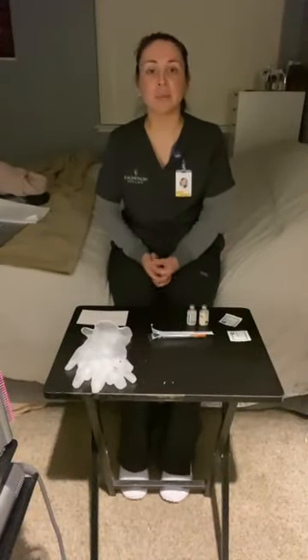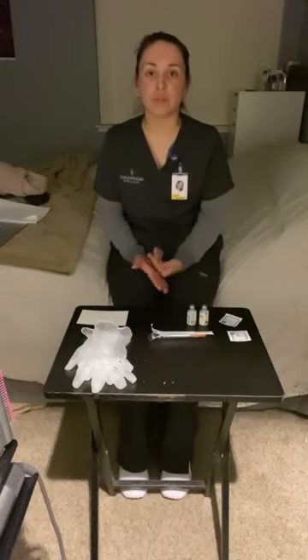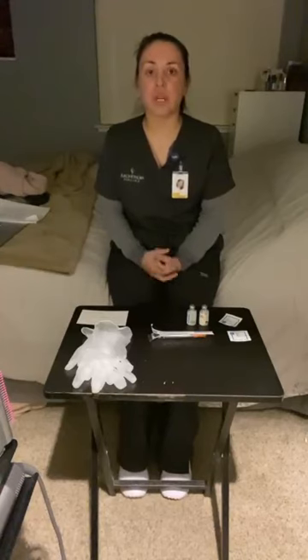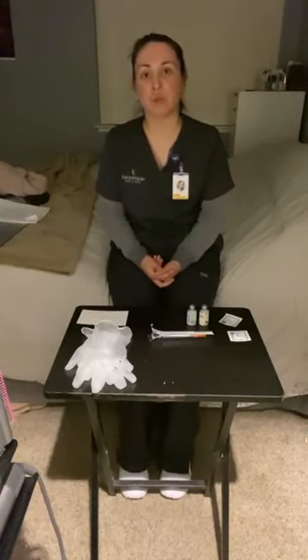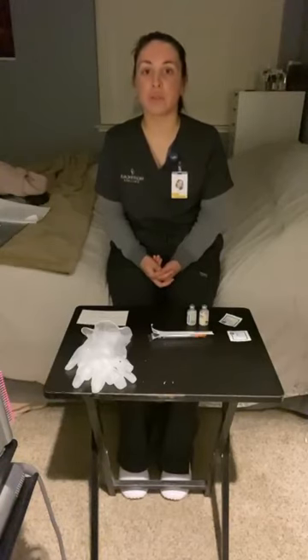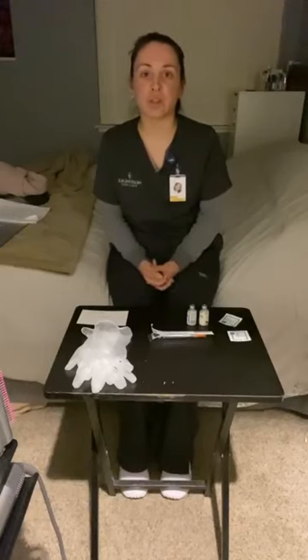My name is Kayla and I'm going to perform a drawing up insulin skills video. So first I would verify the healthcare provider's order. I would verify my 6 rights of medication administration, which include right patient, right route, right time, right drug, right dose, and right documentation. I would check the medication order in the EHR.